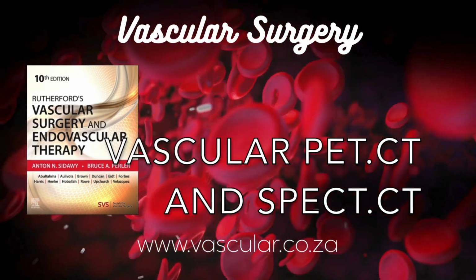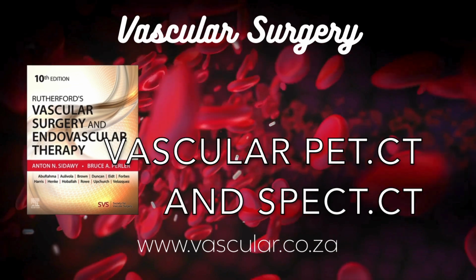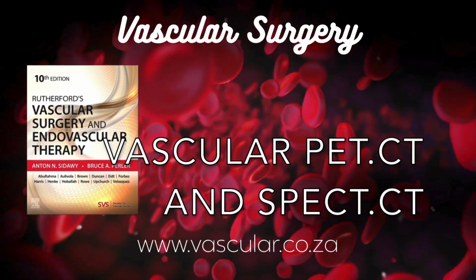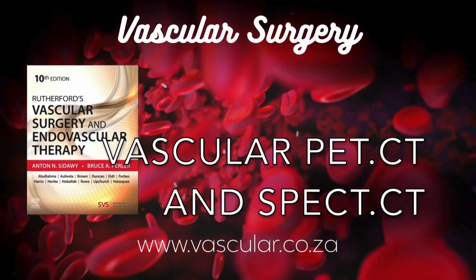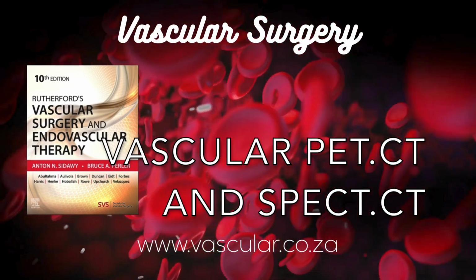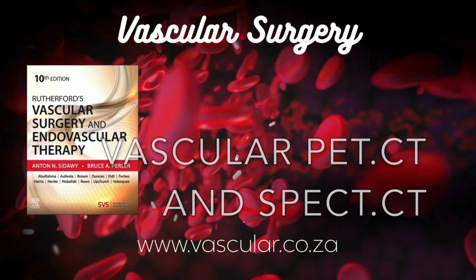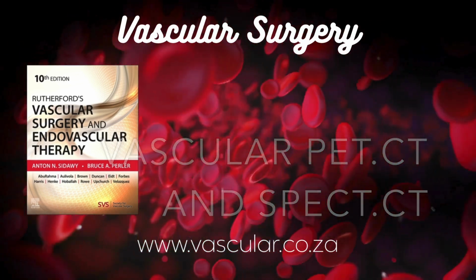Right, let's break that down. SPECT stands for Single Photon Emission Computed Tomography. Here, the tracer emits single photons, kind of randomly. Okay. A gamma camera rotates around you, picks up these photons, and reconstructs a 3D image of where the tracer went. But the resolution isn't super high, and sometimes signals from different depths can overlap, making it a bit blurry, lower contrast. Got it. A bit less sharp.